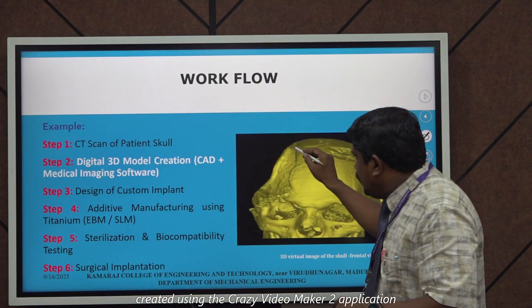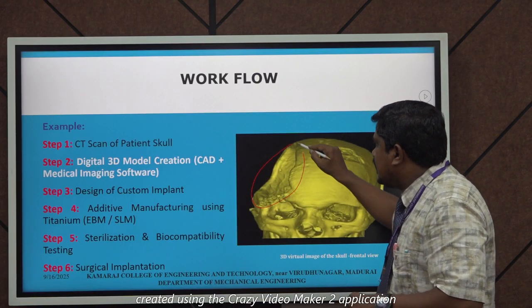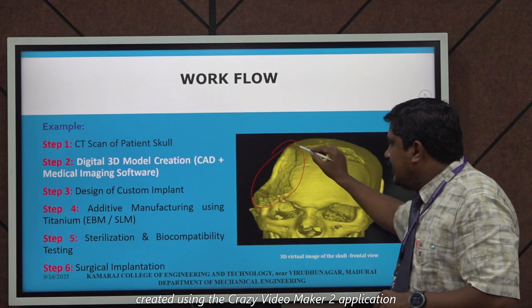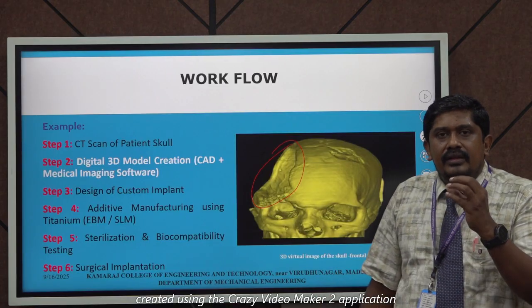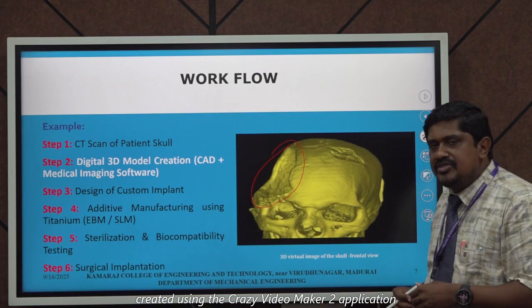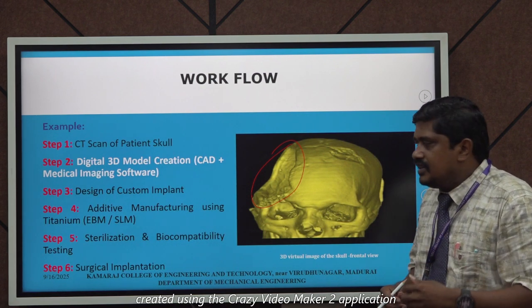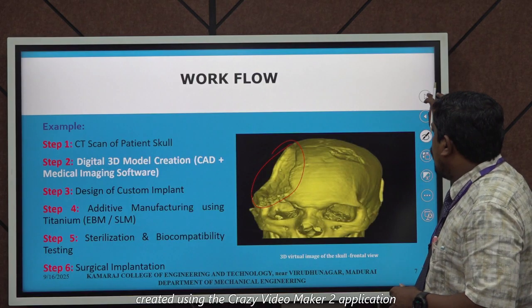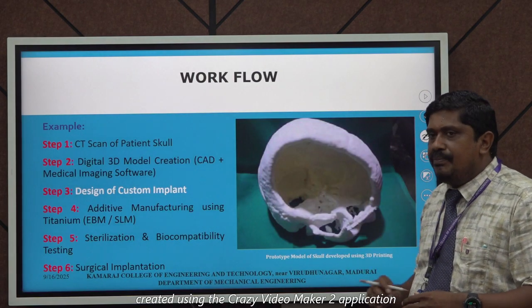This is the actual dimension of the skull. This is a broken head. So the broken head data, the 3D image, can be created by using medical image softwares, as we discussed already. And after the image creation, we go for designing a customized implant.